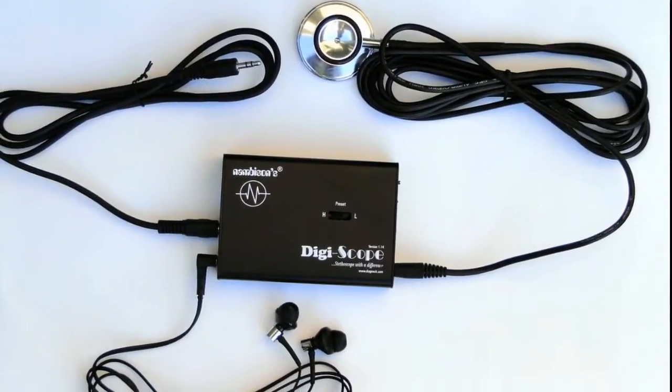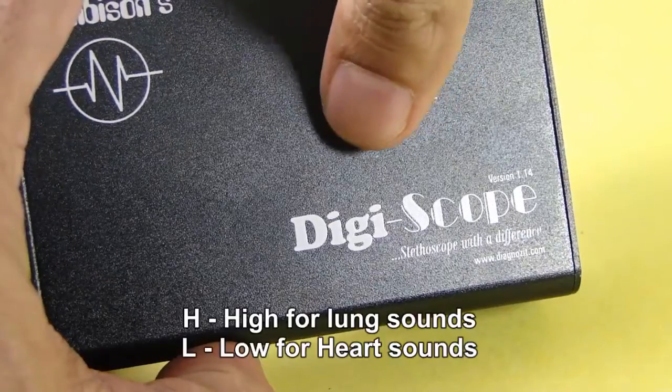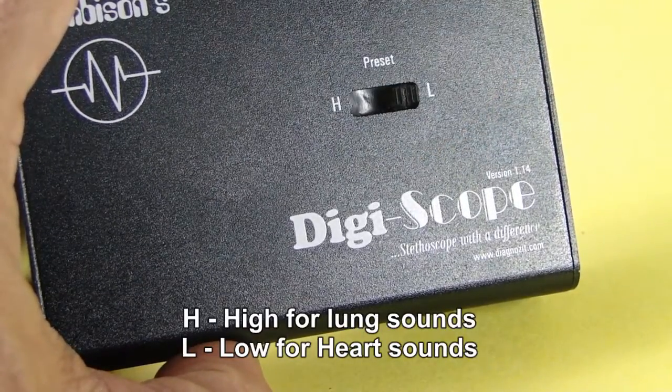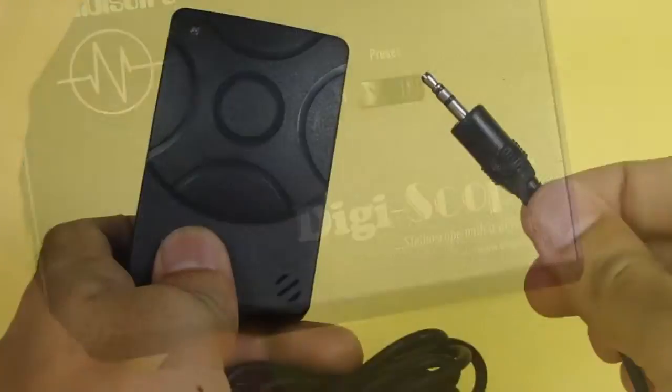This is the right way of making connections. On the top panel you will find a high and low frequency filter. Lung sounds are better heard on high frequency, and heart sounds are better heard on low frequency. Make adjustments according to your needs.